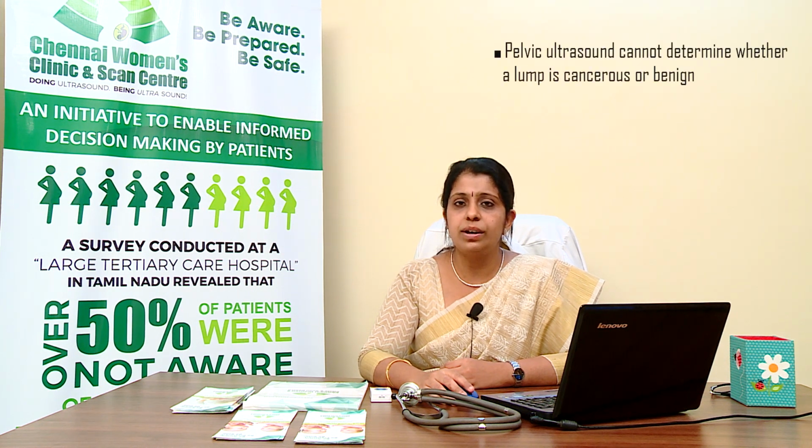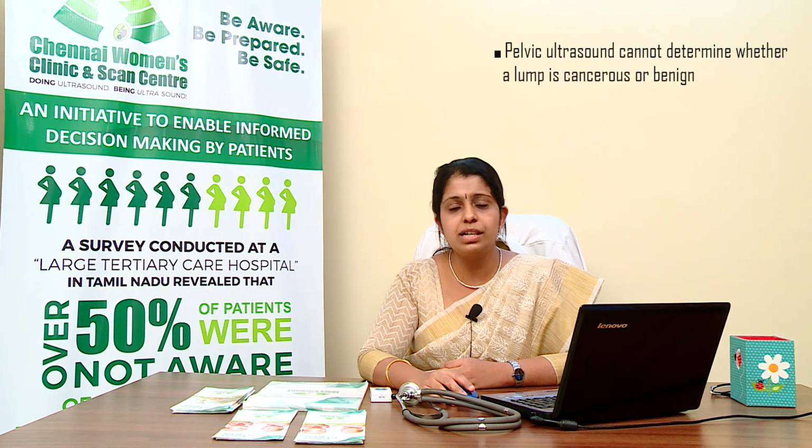A pelvic ultrasound cannot determine whether the cyst or the tumor is either benign or cancerous in nature. Hence, further testing is warranted.